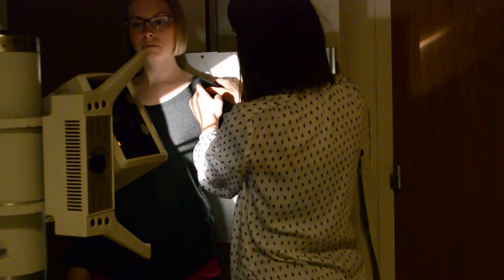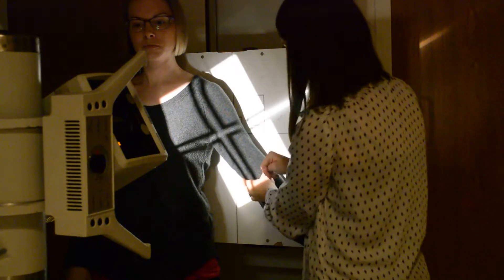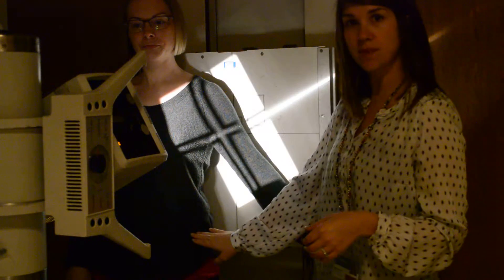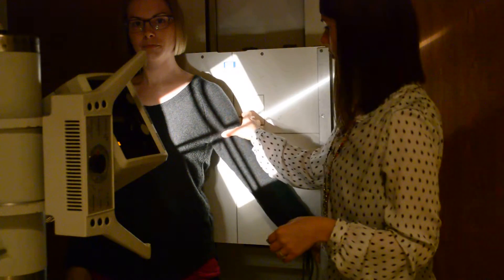You can keep the tube head running with the long axis of the IR. Make sure you're getting the entire humeral head. I've got light there, and lights below my condyles. This is Libby's left, so I would put a left marker there. Give her gonadal protection. Measure exactly through your central ray.